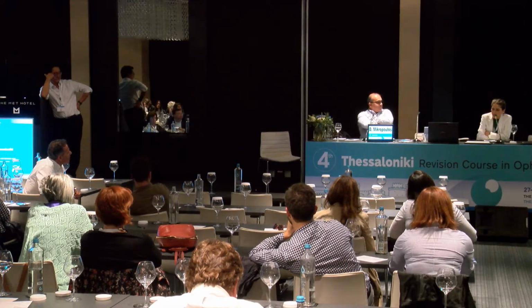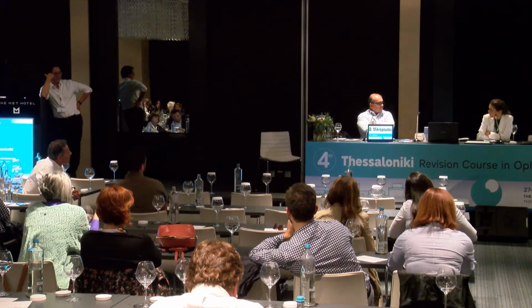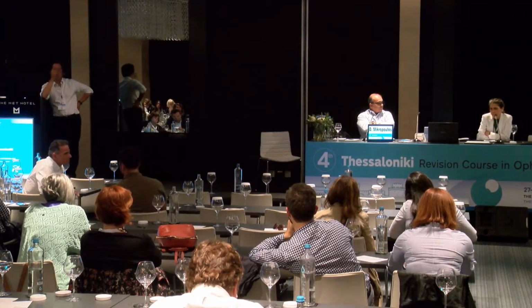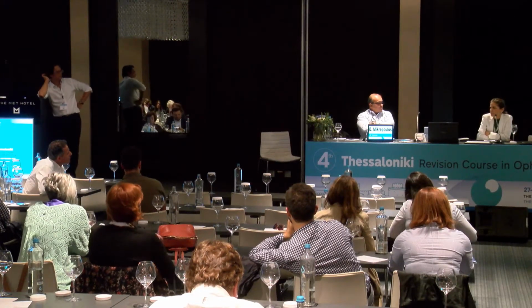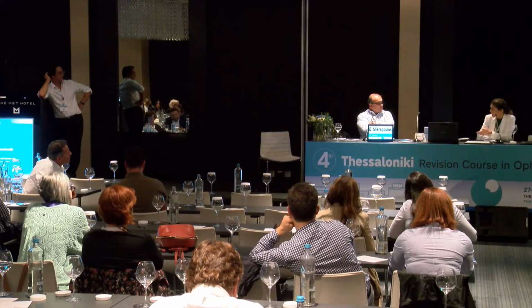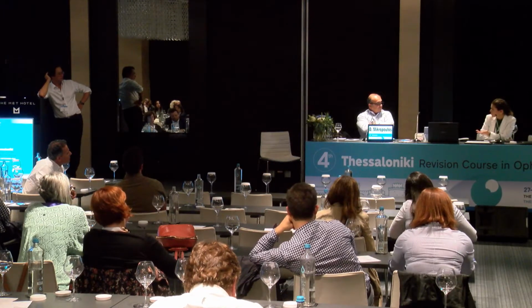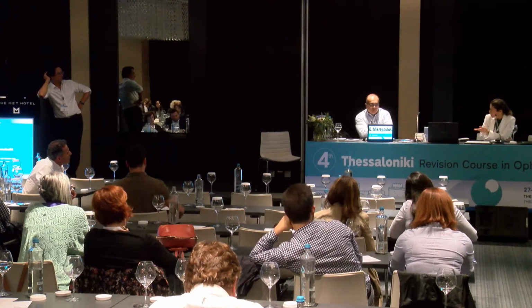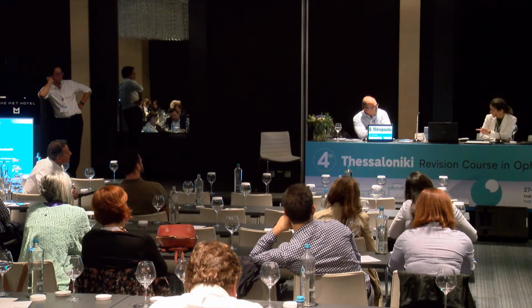Purely for the purposes of glaucoma, I would prefer the visual field because the visual field is a better reflection of what affects the patient's life. The disc and visual field correlation is not very good. You may be seeing OCTs which, even if they are abnormal and it's true, what does that mean for the patient? What does that correspond to? So, you see, unless you have a visual field to measure your patient's vision, you have absolutely no idea what this glaucoma is. You don't know if it exists, and if it does, you don't know what it looks like.